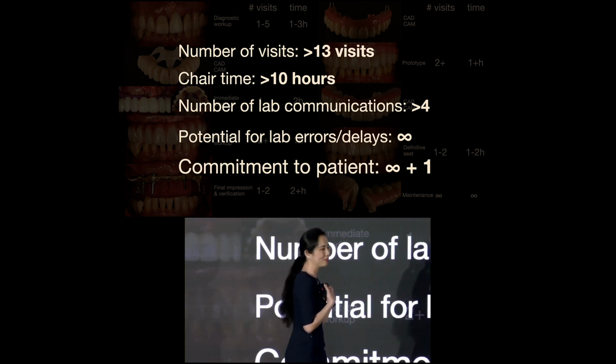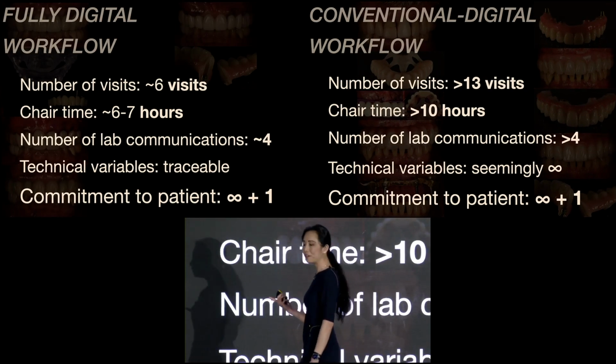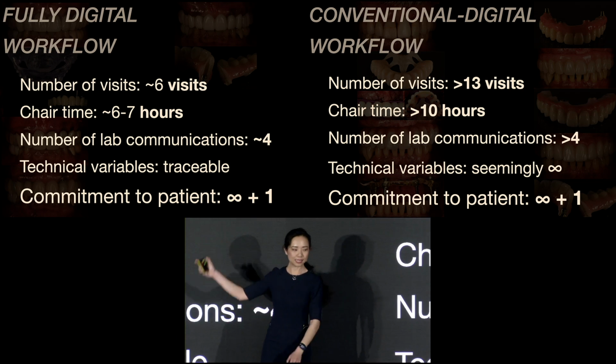They're ours forever until one of us dies or retires. So when we compare side by side a fully digital workflow to the conventional digital workflow, this is what it looks like for me now. I went from 13 visits to less than 6.